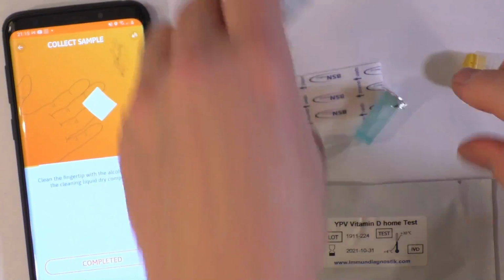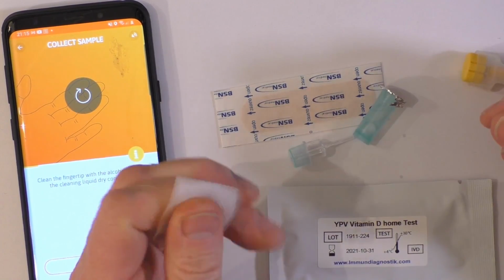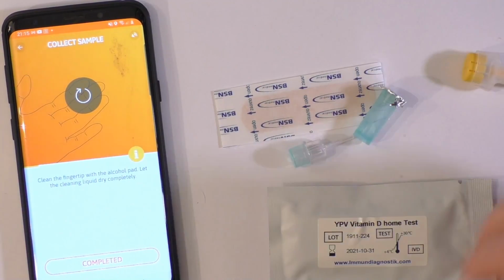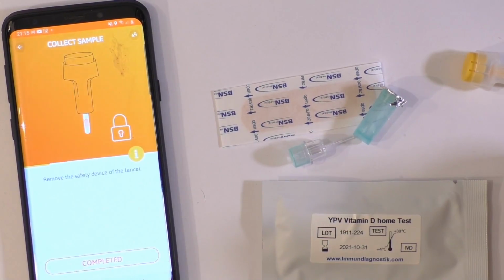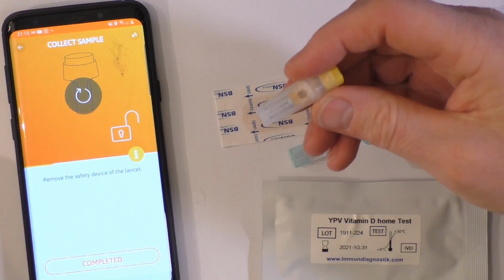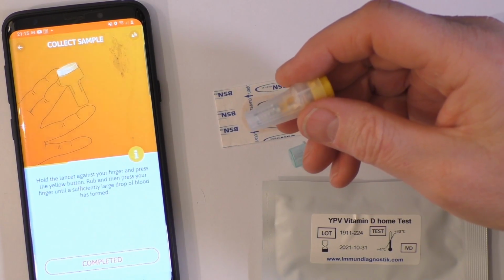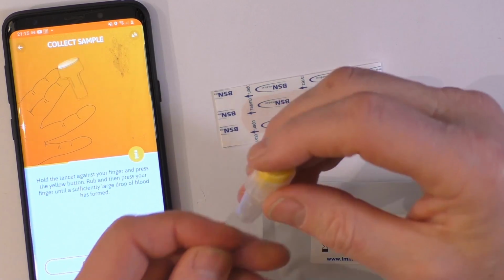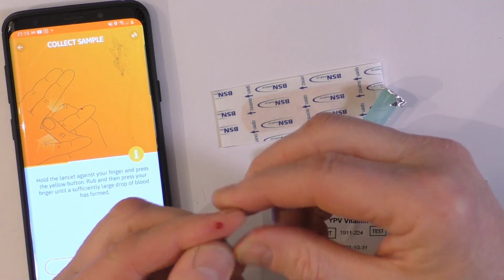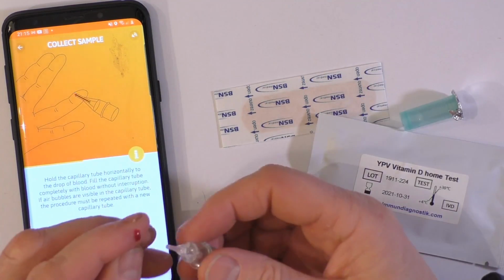I have to clean my finger now. It really is an idiot guide, this one. So there we have a clean finger with an alcohol swab, and we just wave that around in the air to let it dry. Complete. What's next? Oh, get the pricker. I thought there might be a pricker involved, so there's the pricker thing. Right, so I've unscrewed that and removed the safety device. Now I prick my finger. Let's do that for the second time today. Good, so that's me pricked. Right. Complete. Oh, I have to suck the blood up now with this device here.